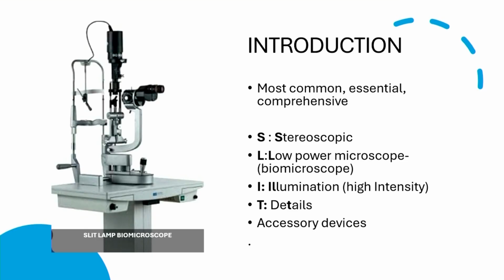Introduction. Slit lamp biomicroscope is the most common, essential, and comprehensive ophthalmic equipment. As the abbreviation SLIT stands for, it is a stereoscopic, low power microscope with a high intensity illumination to view the details of the living eye. It also uses accessory devices.